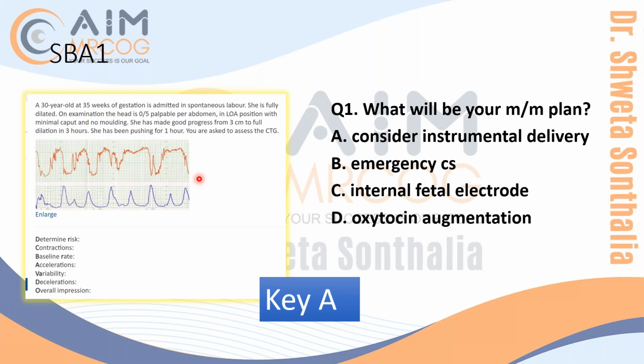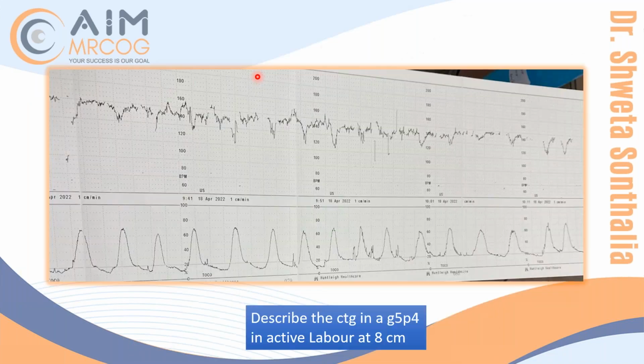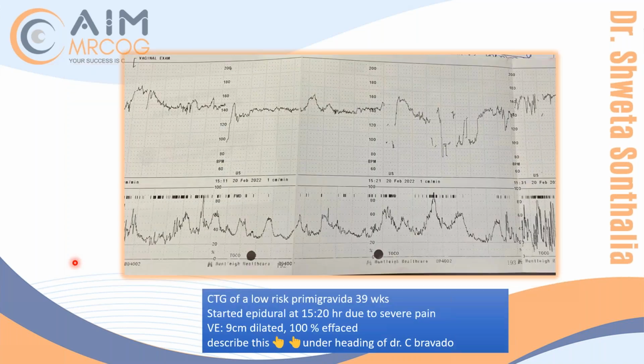And can you show me the previous CTGs we discussed, if we can go over them once more? In the previous CTGs you showed, is there one where the contractions are not defined? Like in this one the contractions are defined. Here, maybe? Is it not defined?